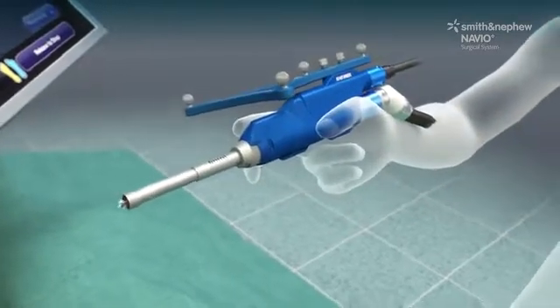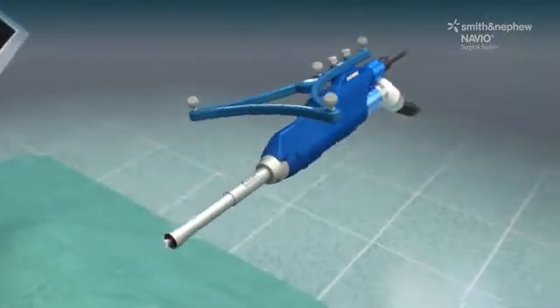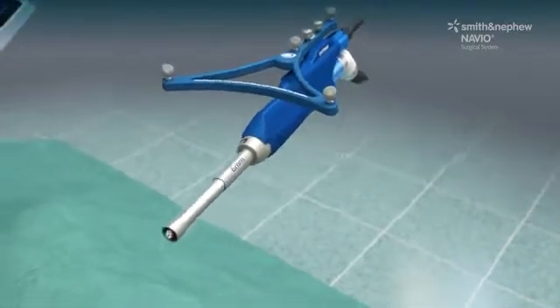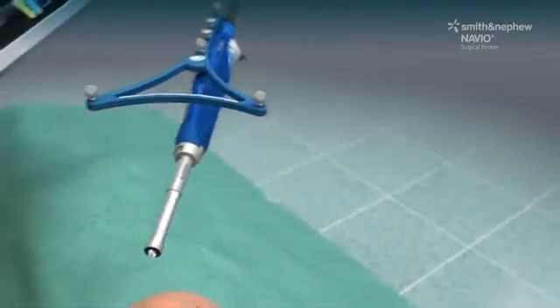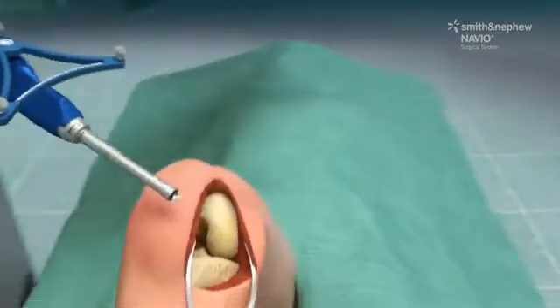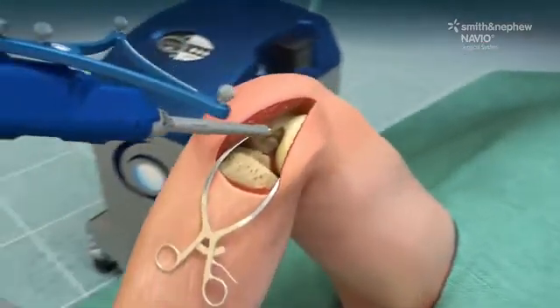Robotic assistance is delivered through a hand-held tool. Computer navigation tracks the position of the robotics-assisted handpiece relative to the bone surface.